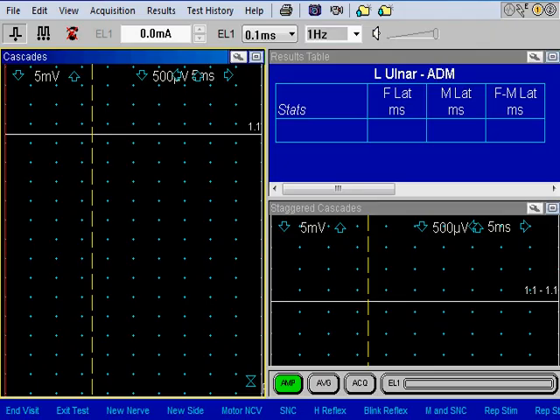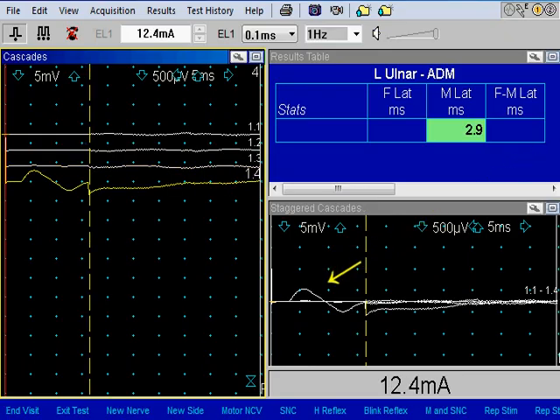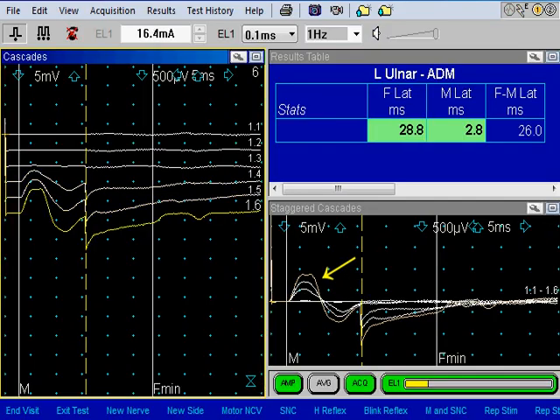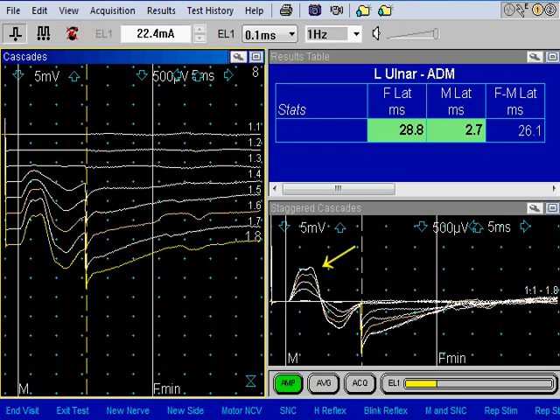Let's begin stimulation to reach the supramaximal level. Increasing the intensity gradually. Note the response. Note the increase in the amplitude of the response when I increase the intensity. And now the amplitude didn't change, indicating that I am at supramaximal stimulus level.